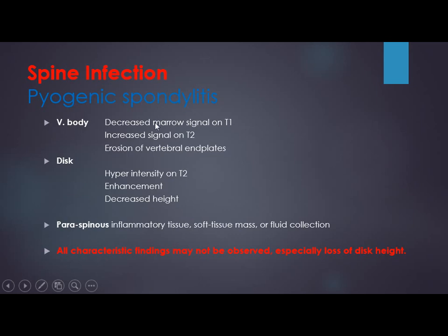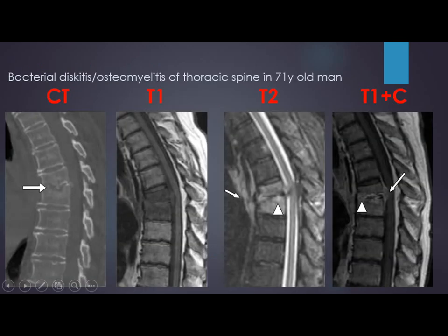Spine infection, whether pyogenic or TB, shows changes in the vertebral body: decreased marrow signal on T1, increased signal on T2, and erosion of the endplates. In the disc there is hyperintensity, enhancement, and decreased height — though this is not always the case, sometimes the disc may be normal. There may be paraspinous inflammatory tissue and fluid collection. This CT scan in spondylodiscitis shows erosion with decreased disc height. On T1 we see low signal of the vertebrae; on T2 they are highlighted. With contrast, there is enhancement of the disc endplate and adjacent soft tissue, with an epidural component.